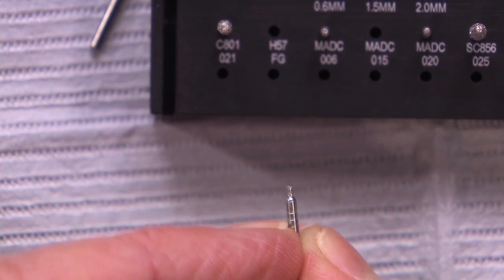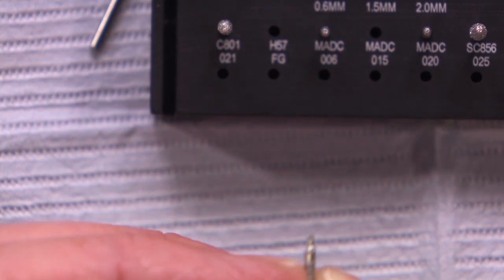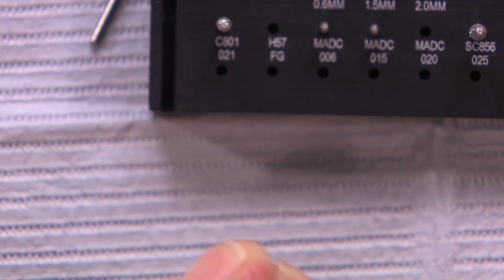So it's a depth cutter, and again, because of the shape of this, you sink it right down to that little shoulder and it stops. So you can't go too deep with these depth cutters. They're self-limiting in nature. And here's the 2 millimeter depth cutter.